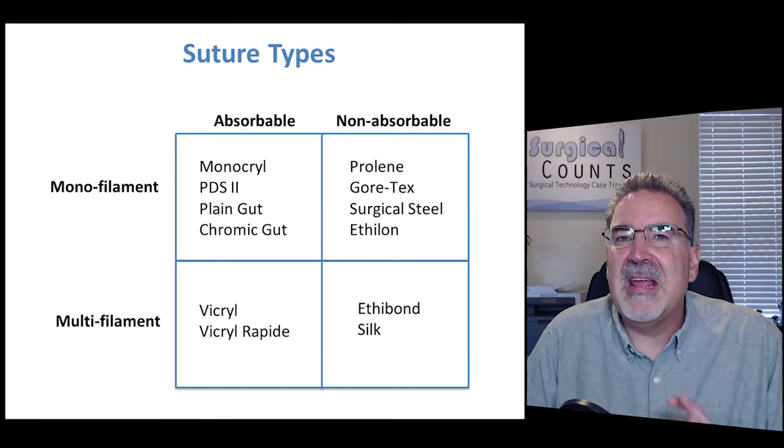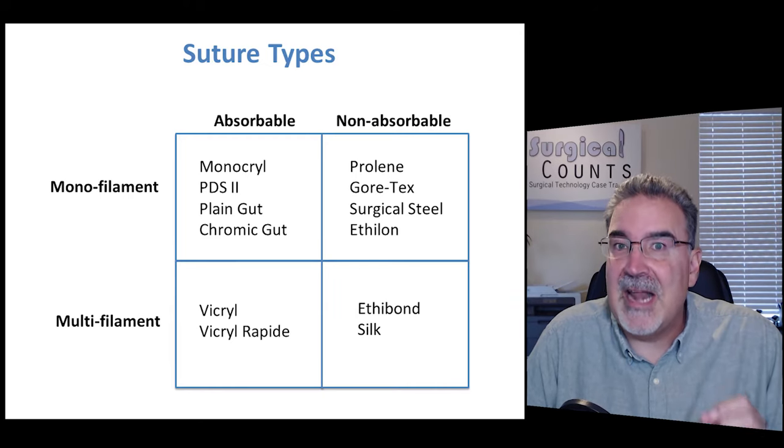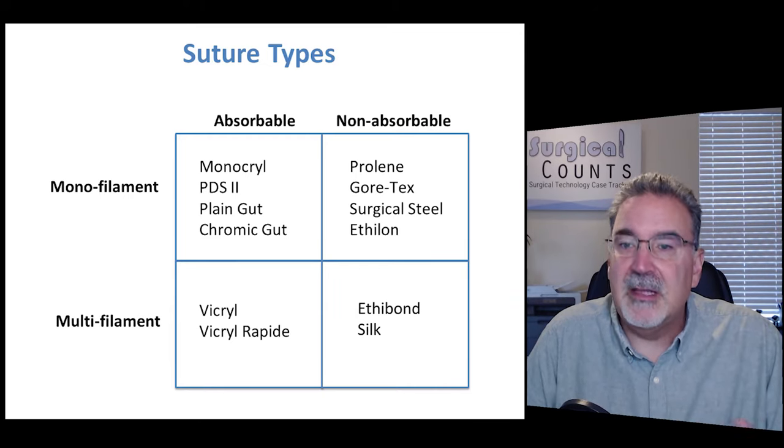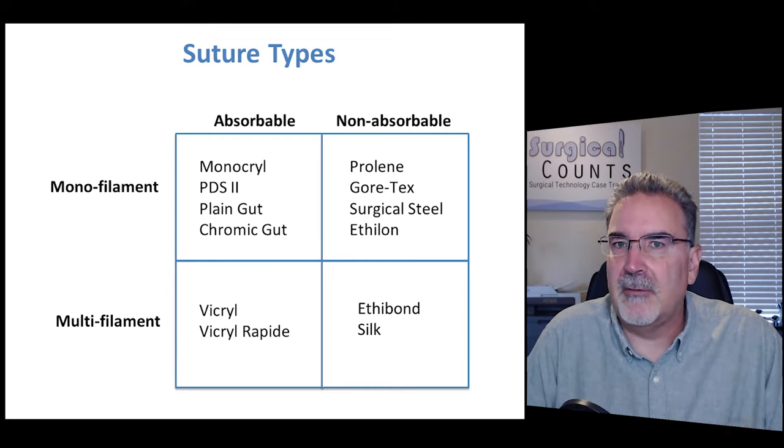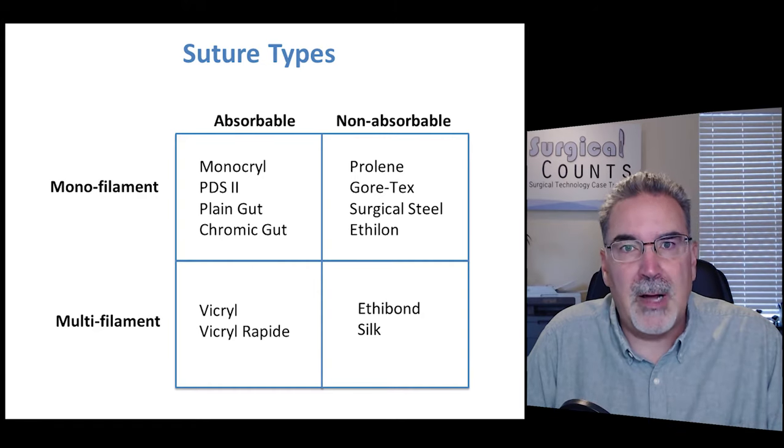So again, there are many, many different types and names of sutures out there. These are just some of the more popular ones, some of the more common ones that you're going to see in the hospitals. So we're just going to cover a few of these just to give you a little introduction to some of the more popular, more common suture that's out there.